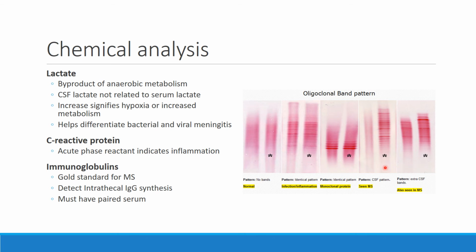In the last two, we're seeing where the differences come into play. In this first one, which is your classic MS, in the serum lane we have what looks like a normal amount of IgG. The IgG is separated, and there are no dense bands anywhere along the lane. However, when we get to the CSF, it's like two different patients almost. You can see these dark bands of increased Ig production, and the bands have no correlating partner in the serum. So this is the classic pattern for multiple sclerosis.